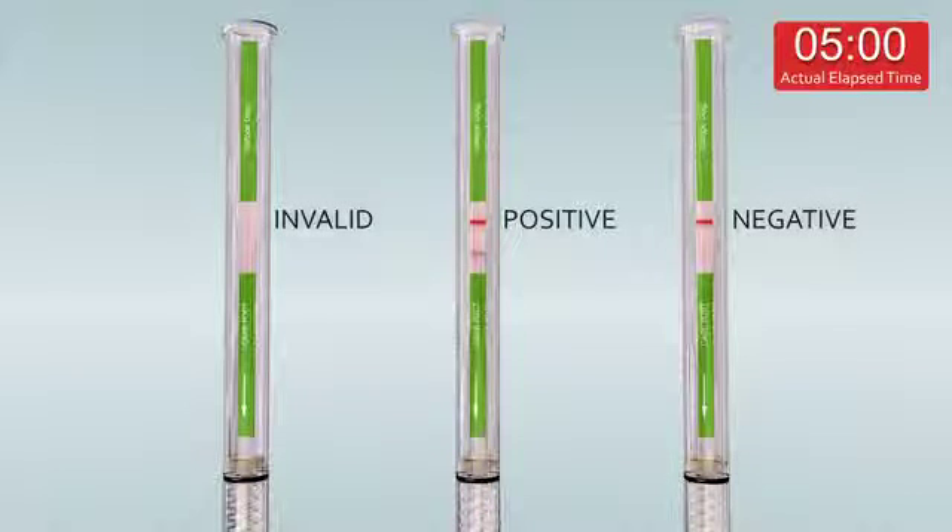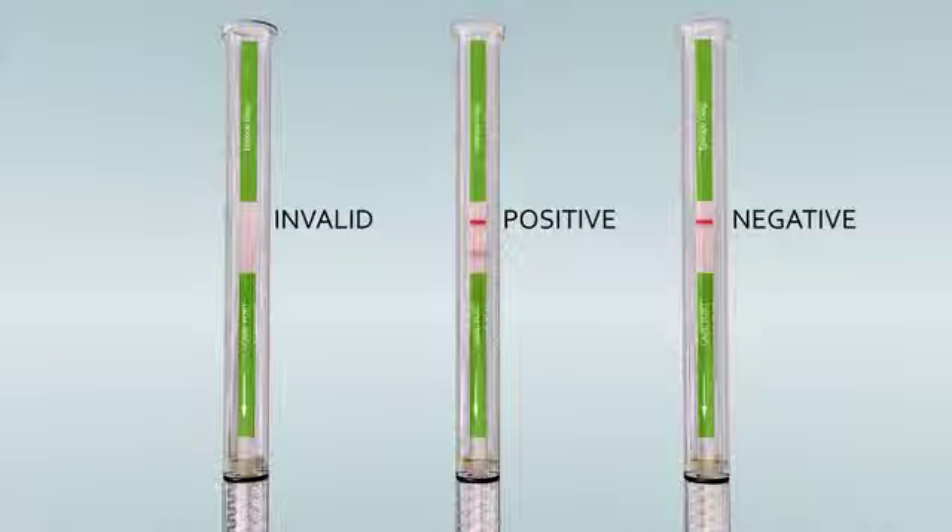Wait for the color bands to appear. Read the results at five minutes. A positive test will show two red or pink lines. A negative test will show a single red line. No visible line is the result of an invalid test and must be repeated with a fresh kit.